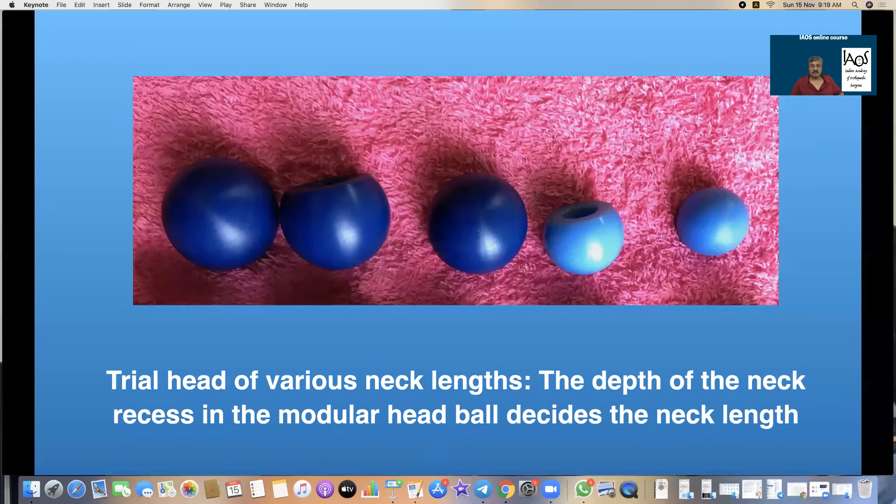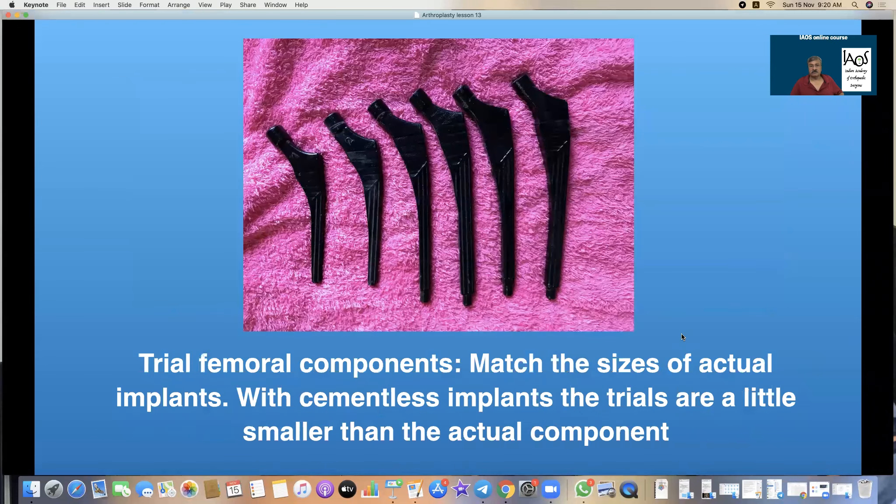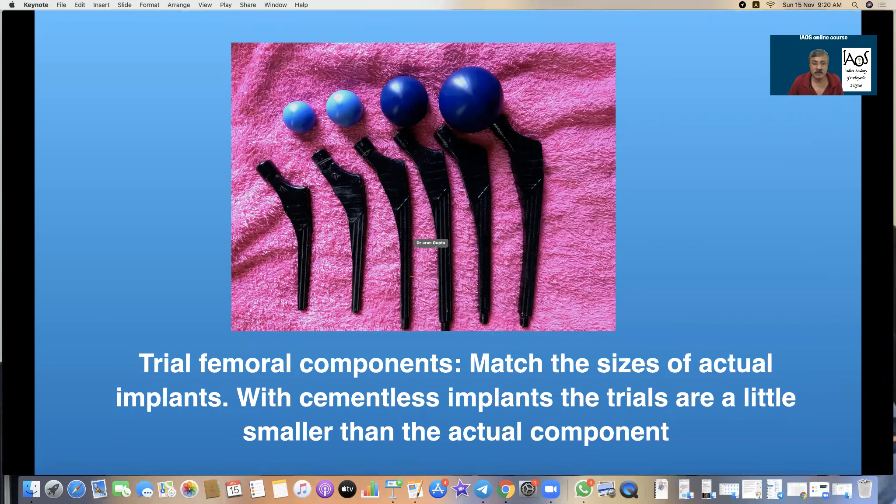Heads of various neck lengths and diameters are available as trial components. The diameter remains constant depending on the situation. The depth inside the 12-14 taper decides whether the head is a long neck, medium neck, or short neck. These are the trial femoral components — they match the size of actual implants. With cementless implants, the trials are smaller than the actual component by 0.5 mm so that final fixation is rigid and solid.